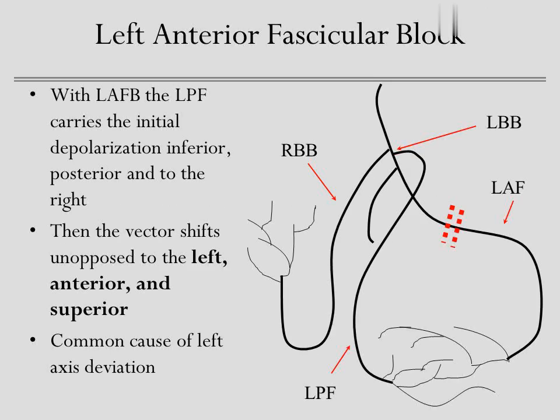Left anterior fascicular block. With LAF block, the LPF carries the initial depolarization inferior, posterior and to the right. Then the vector shifts unopposed to the left, anterior, and superior. Common cause of left axis deviation.